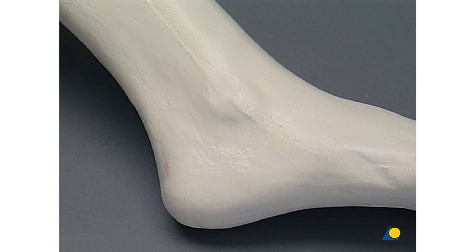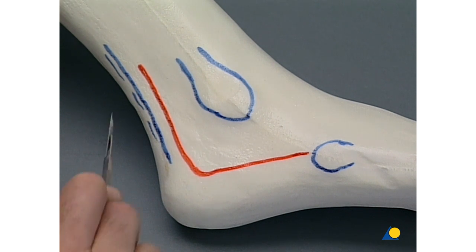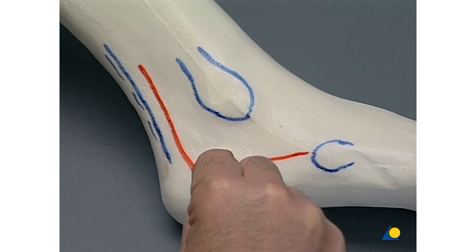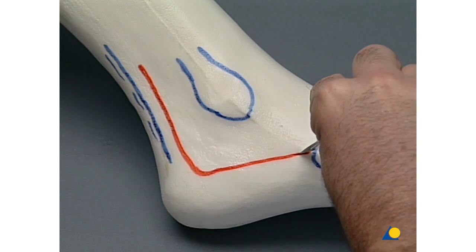The fracture model is a foam-embedded model. First, we mark the anatomical landmarks and the planned incision: here the lateral edge of the Achilles tendon, here the lateral malleolus, and the base of the fifth metatarsal bone. The skin incision is performed in two cuts, whereby the vertical cut is made parallel to and about 1 to 1.5 centimeters in front of the Achilles tendon. The horizontal cut is aligned with the fifth metatarsal bone. The two cuts are connected with a small curve.